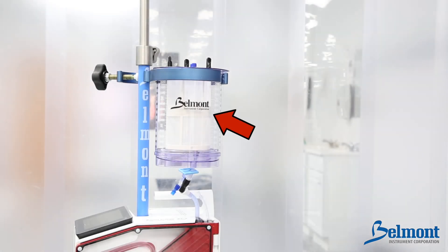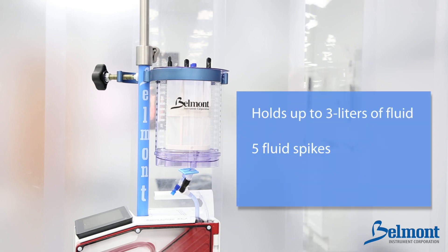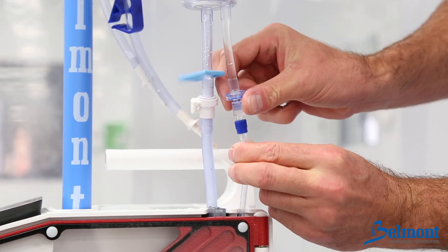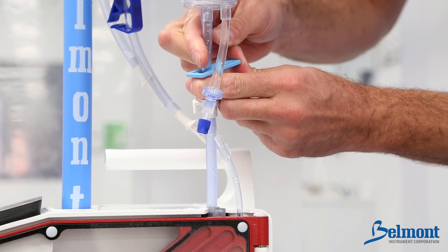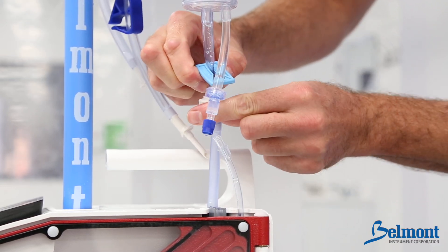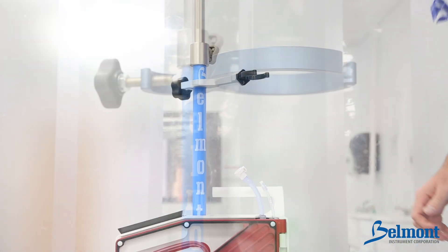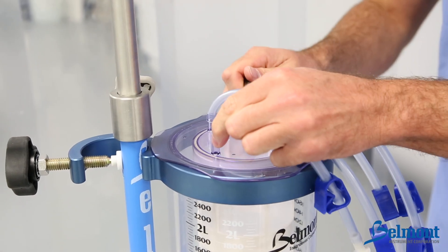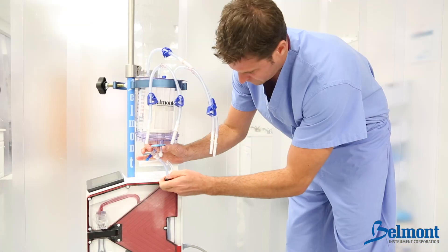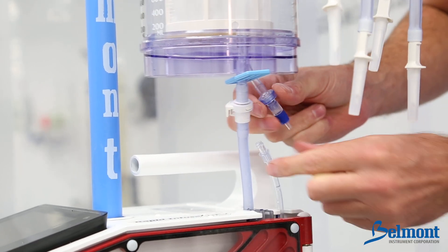The optional large volume reservoir can be added at the beginning or any time during the procedure. The LVR will hold up to three liters of fluid, has five fluid spikes, and can be added to the system in less than one minute. Disconnect the small reservoir by unscrewing the lure fitting on the recirculation line. If the small reservoir contains fluid, close the blue clamp to prevent a spill before disconnecting the fluid line. Disconnect the fluid line by pressing the quick release tab while separating the fluid tubing. To install the large volume reservoir, attach the large reservoir holder, unpack the reservoir, connect the fluid spikes, and place it in the holder. Attach the large volume reservoir by connecting the fluid line to the quick release connector. Connect and tighten the recirculate line with the lure fitting.